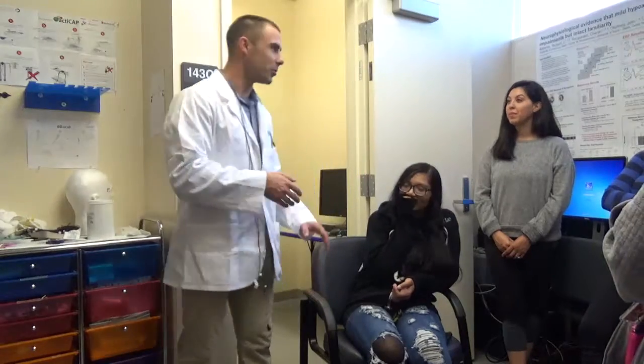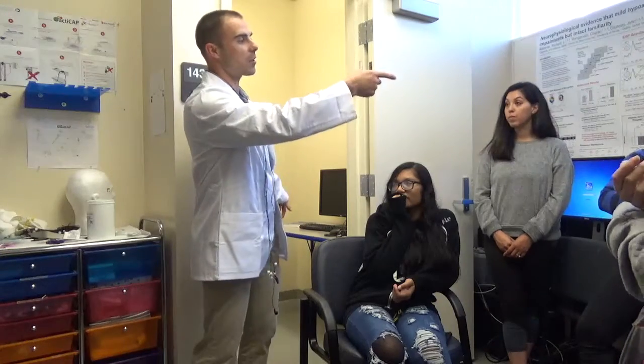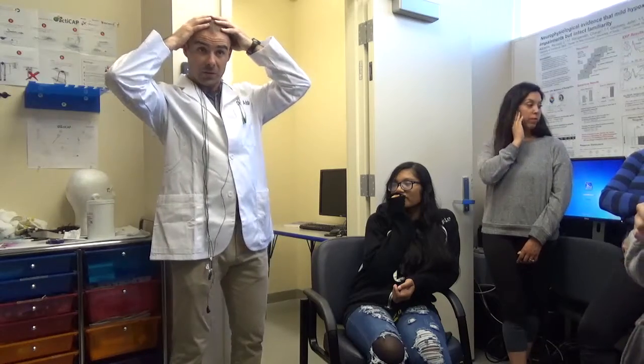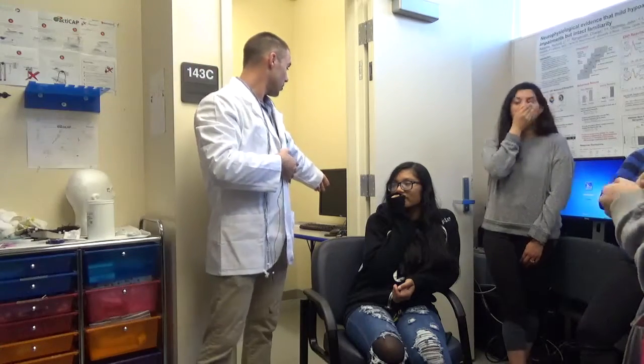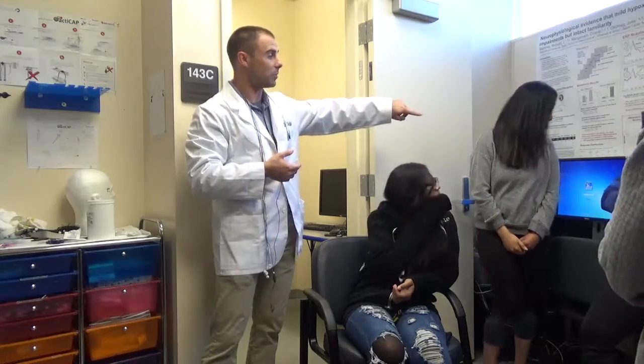where they have a private little session, where they're not getting tested on what they think about something with us hanging over their shoulder. You want them to feel comfortable; this is just their thing. So we close the door, and that computer is showing on the screen what that computer is presenting. The electrodes that are recording her brain activity are fed through our power supply, through a connection through the wall, and they get recorded on our left-hand side computer there. Okie doke. So those are the basic setup.